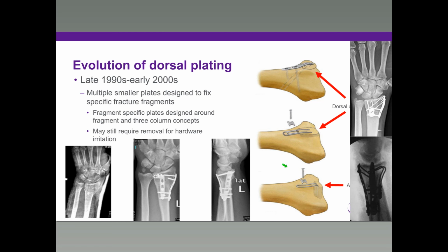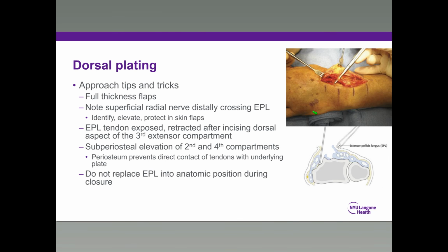And so you see an x-ray that looks like this one to the far right or this one below it, and it just looks like a bunch of little K-wires and things in there. That was why we came up with our derogatory terminology, but clearly these guys had a better idea of what was going on and what was appropriate than what we'd been doing with dorsal plating before. The problem is this is still directly under the tendon, so it still may require removal for hardware irritation, but it certainly becomes much less of an issue than the plates that I was using when I was a resident a million years ago.